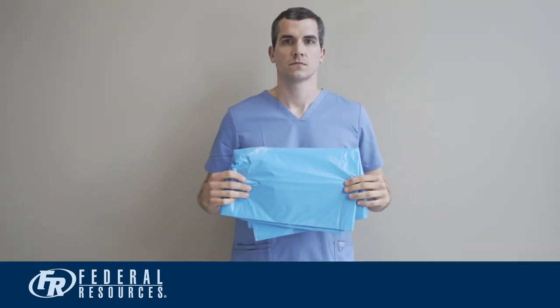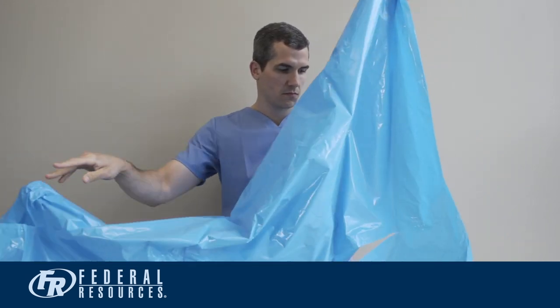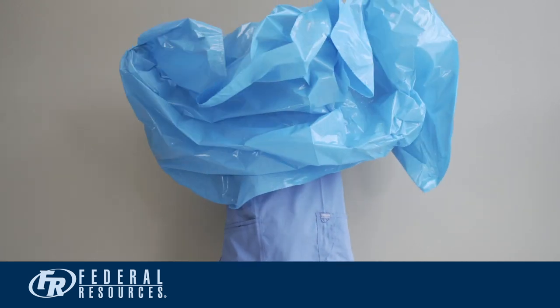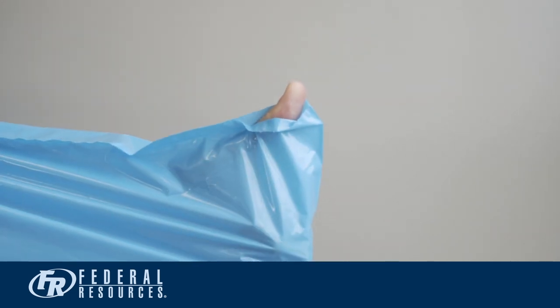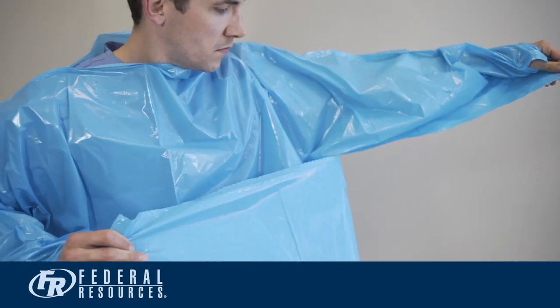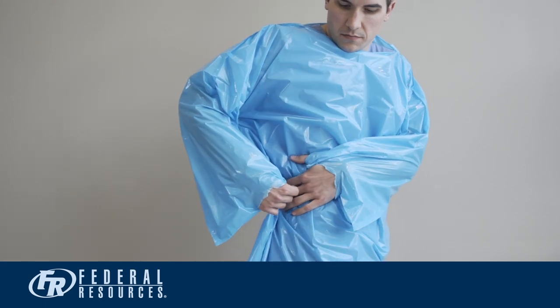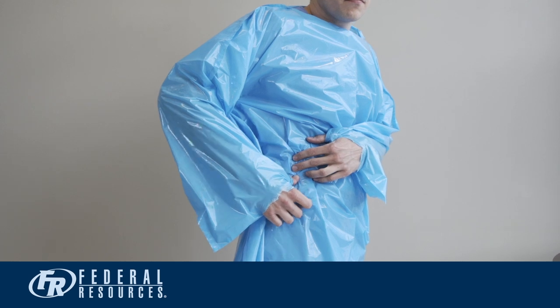Once your hands are dry, you are ready to don your gown. Visually check your gown for defects. If no defects are discovered, place your gown over your head and insert your arms into the sleeves. Insert your thumb into the thumb holes and push your hands through the end of the sleeves. Tear the sleeve perforations to separate the sleeves from the body of the gown. Secure the side flaps on the back or side of the gown with an adhesive label or tape.